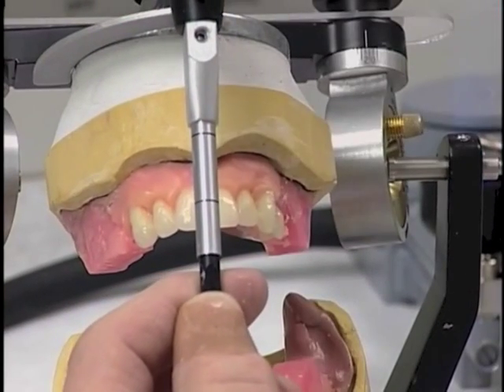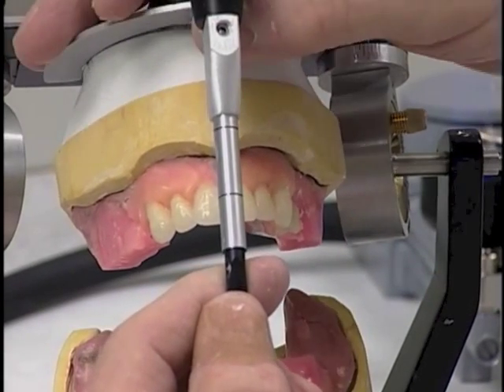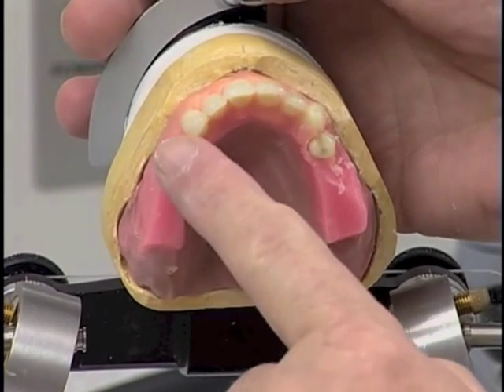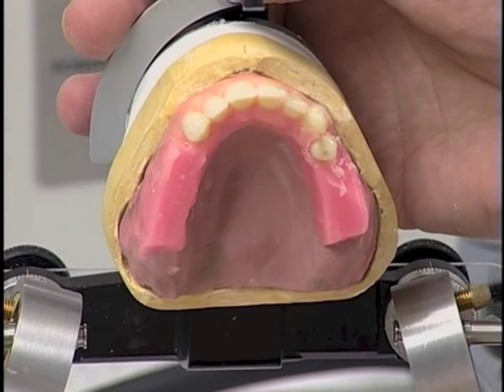Lingual cusp appears to be at the same height as the buccal cusp now. Let's look at the arch form. As we come around on the arch form, we see that we have started an arch form with the anterior teeth, and the buccal cusp falls right in alignment with that arch form.